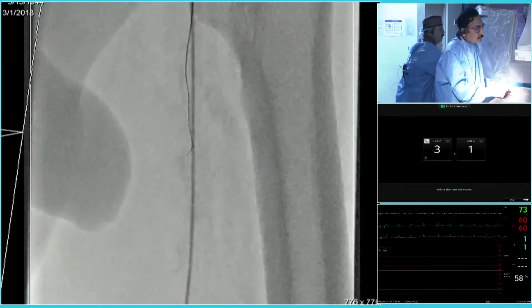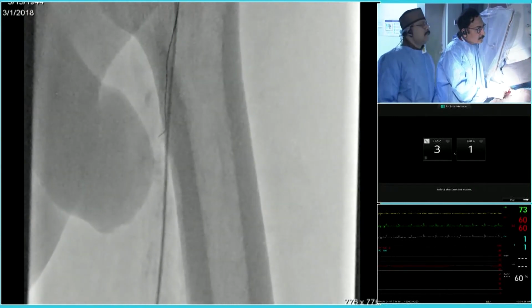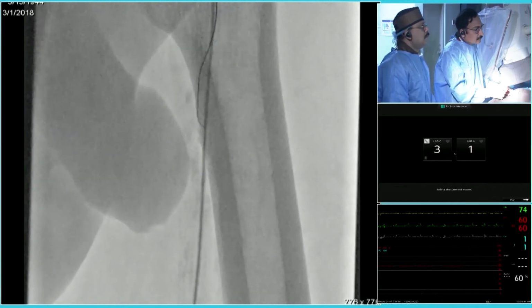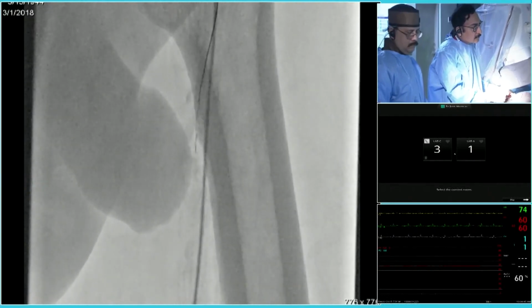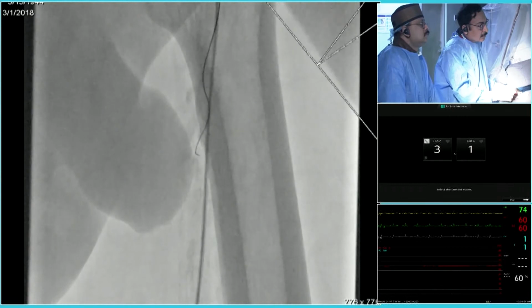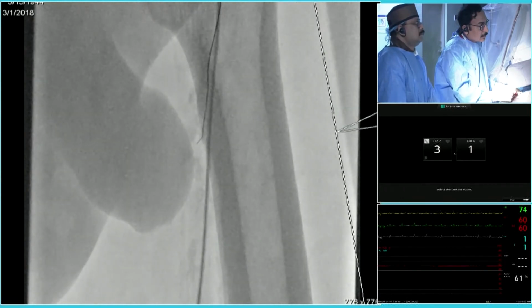It certainly is worth a shot, but the difficulty in these cases is, although we angiographically estimate where we have entered into the false lumen with the first wire, we may miscalculate that because it could very well be much higher up. And even with this wire, you may still be in the false lumen. It's sometimes very difficult to differentiate at what level you have to re-enter. I think, sir, that's right.